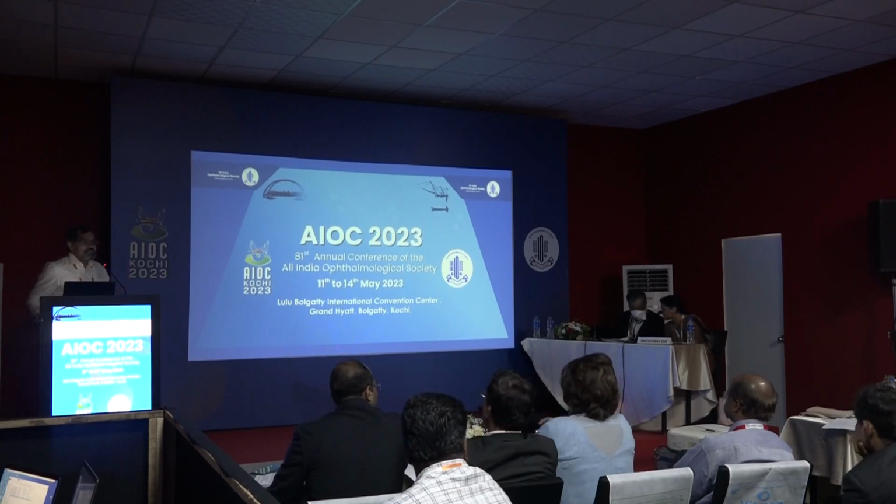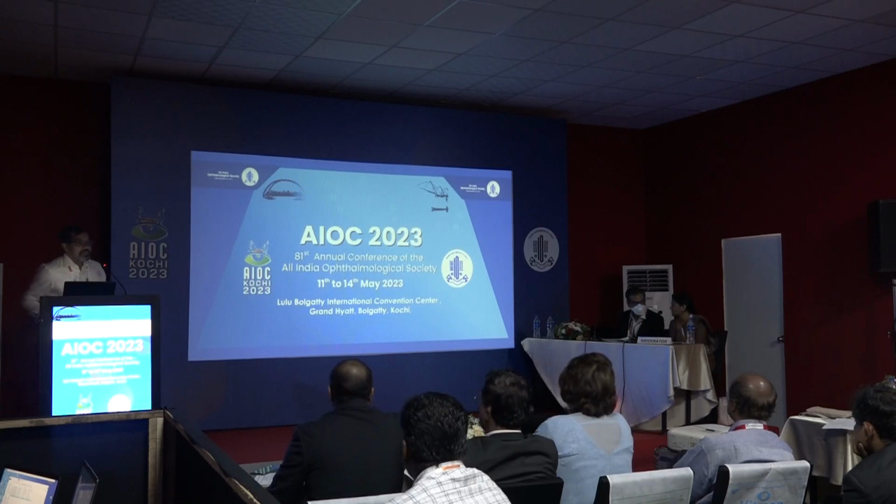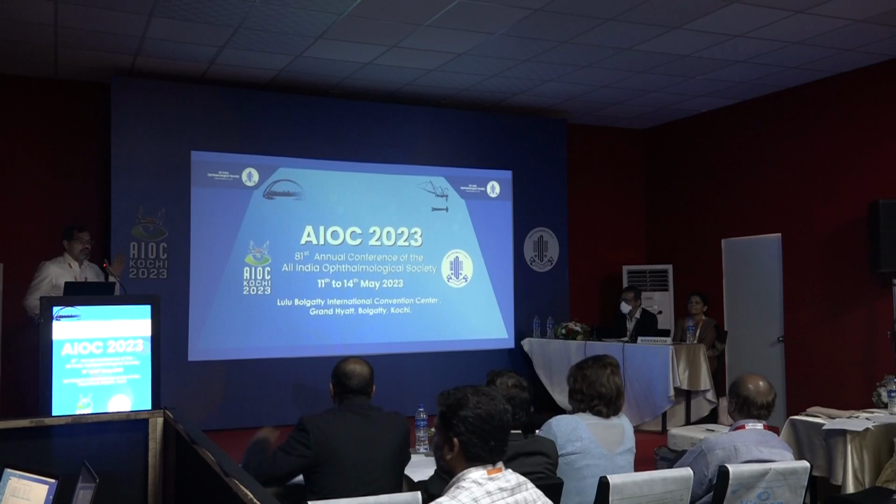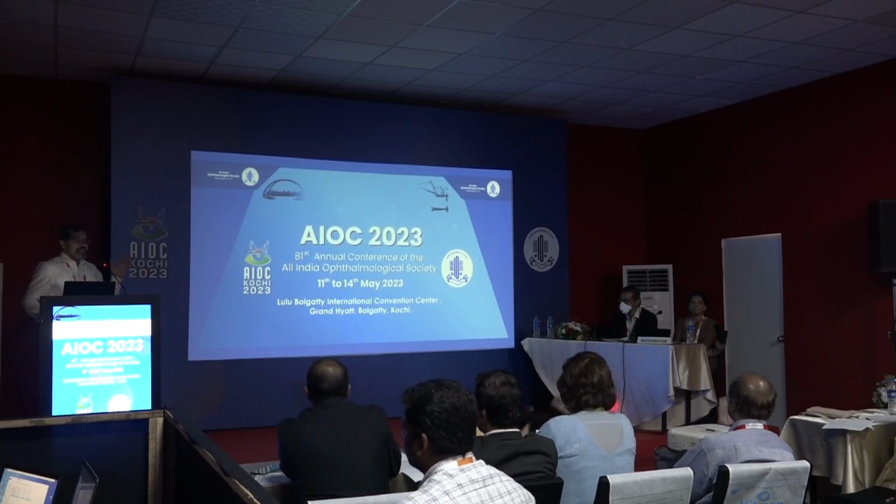It's very risky to put a toric IOL. People pay so much. It's very risky. You get some error. It will measure the steep axis.